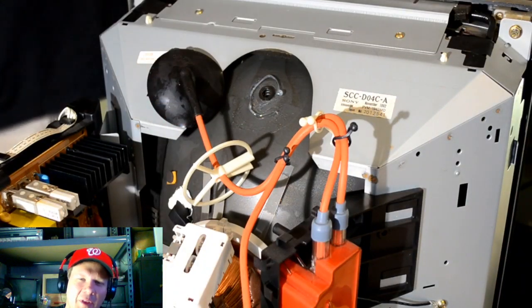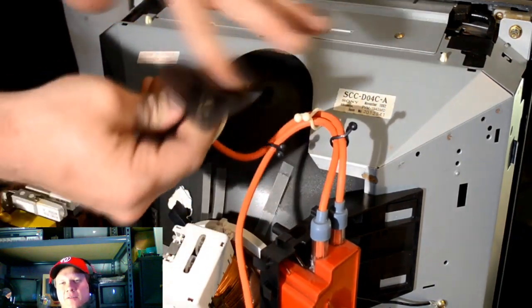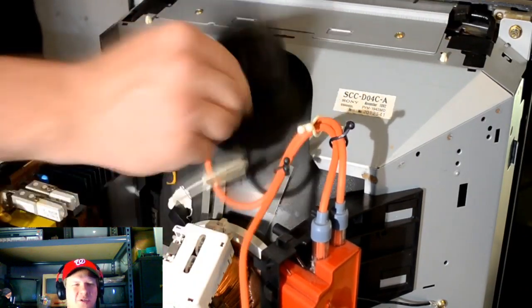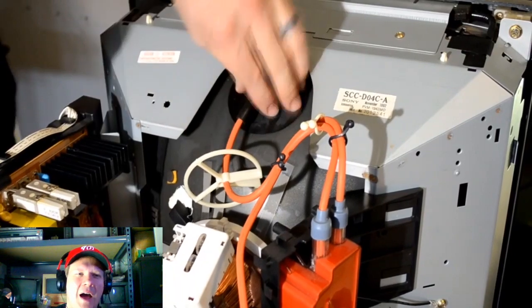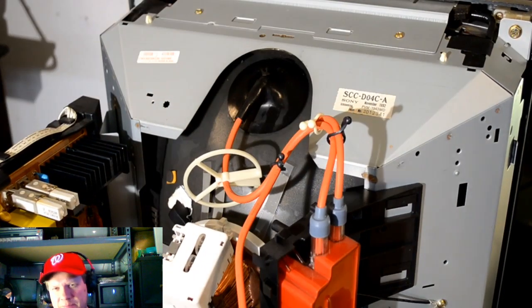And the last thing I did after I put all this together was I did apply some fresh dielectric grease, which will limit the amount of sound that comes off of that flyback area back there. You just make sure there's no dust or hair or lint or anything in that, and then you won't have any crackles or pops. And make sure you get a good seal against the back of your tube.